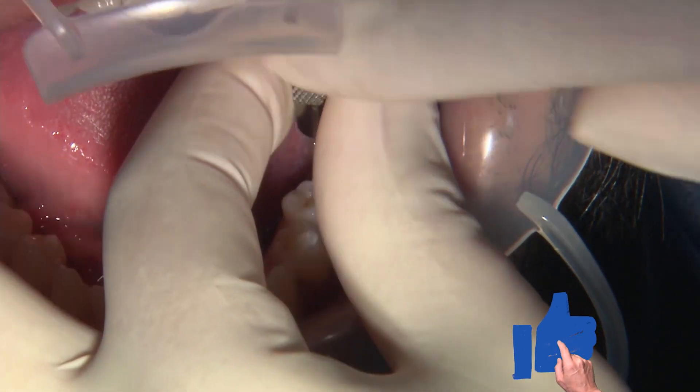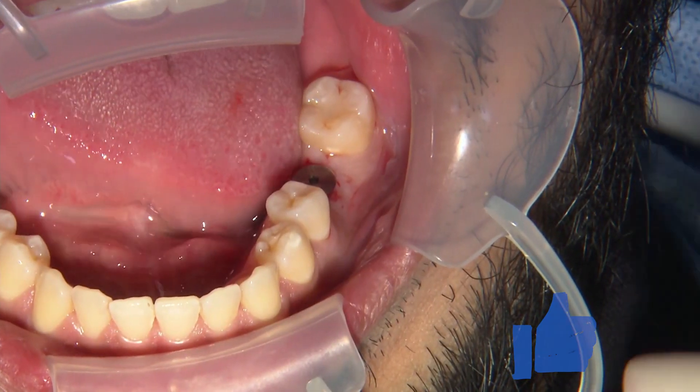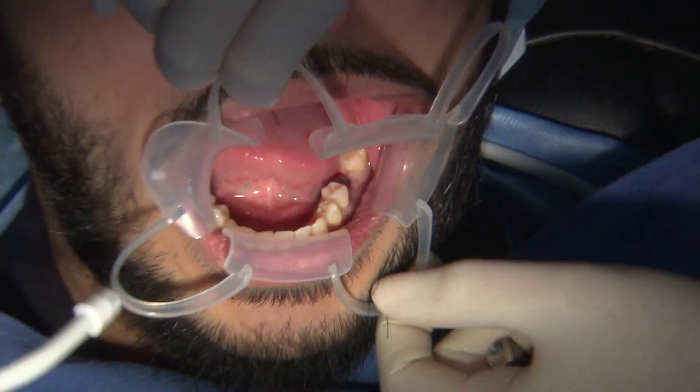Now we can hand tighten our healing abutments and push this out.